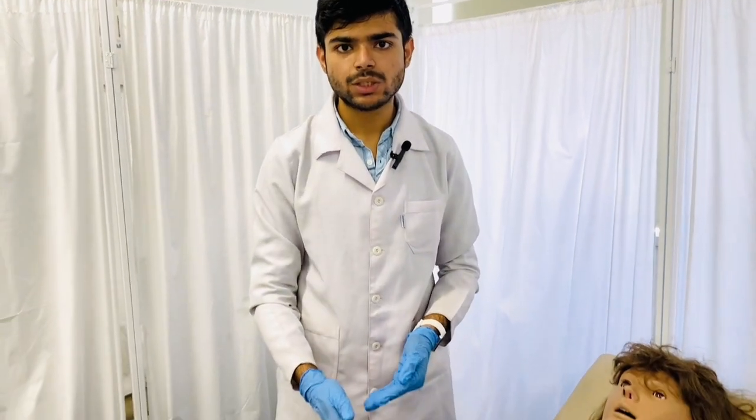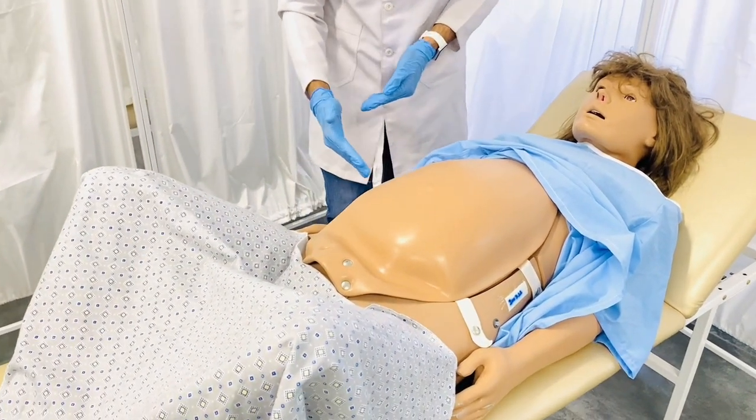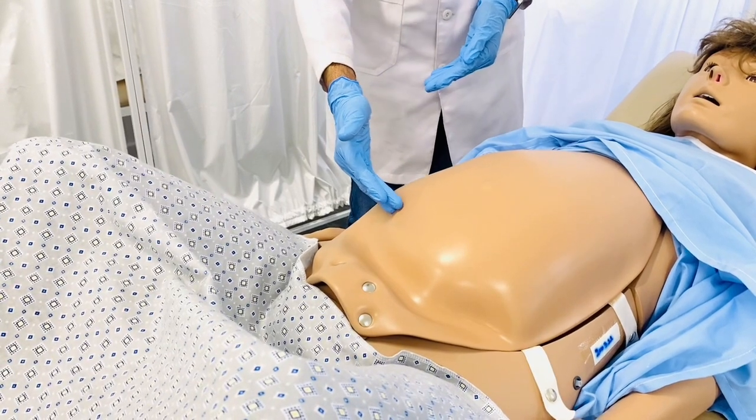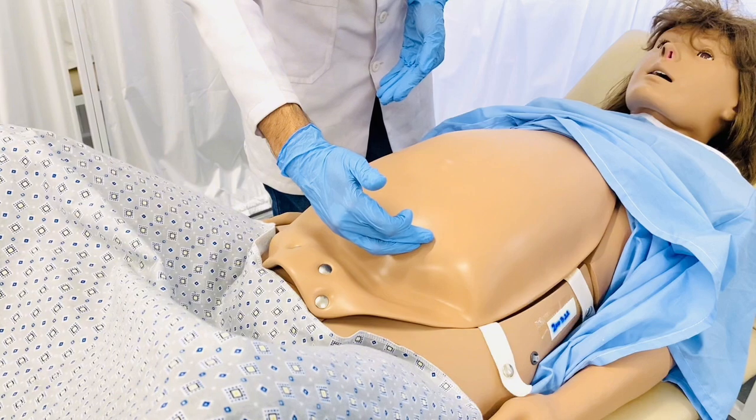Now we know the localization of the fetal back and at which location we can auscultate the fetal heart sounds. There are four main localizations at which the back of the fetus is present: right occipito-posterior, right occipito-anterior, left occipito-posterior, and left occipito-anterior. These are the four main localizations, though others exist. But mostly the fetal back is present at these four locations.